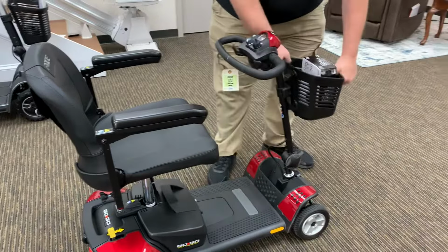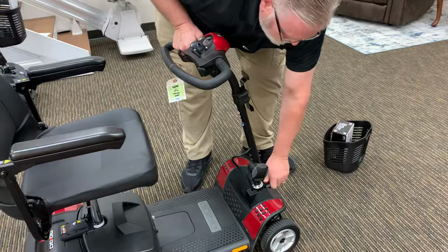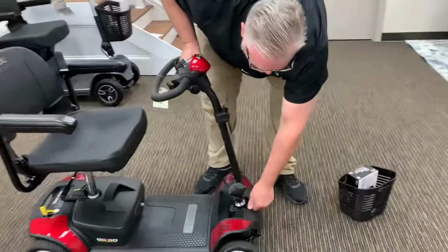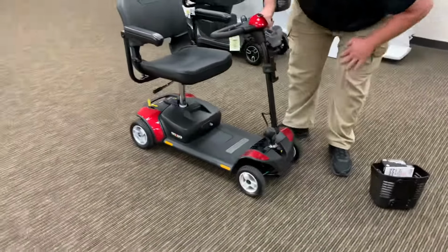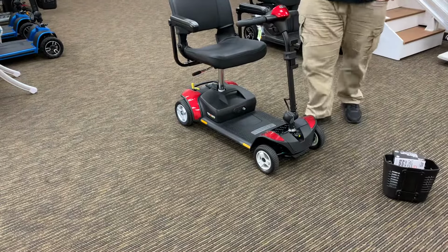So I'm gonna show you how to disassemble it, take the basket off. Now back here, you can lock the wheels if you want to. You gotta hold your mouth just right. It's not the easiest thing. You can lock it. I usually just keep it unlocked, especially for a four-wheel like this.